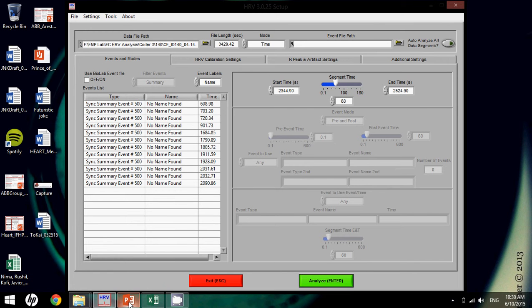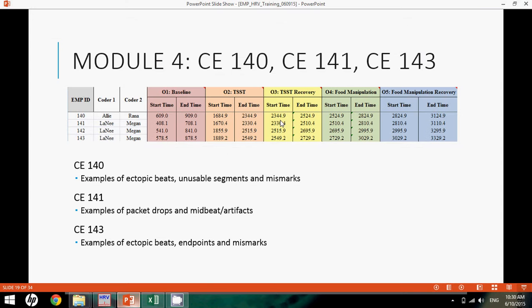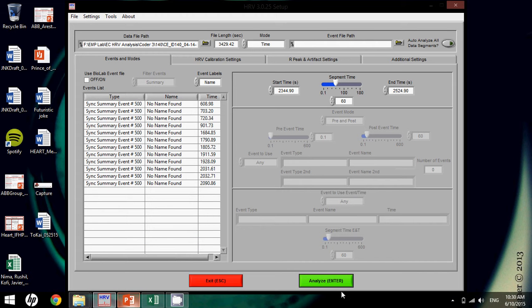It might help to recognize here that it is frequent that research assistants mess these numbers up. So just make sure that you double check these numbers to make sure that you have the correct ones. Looks like we do.